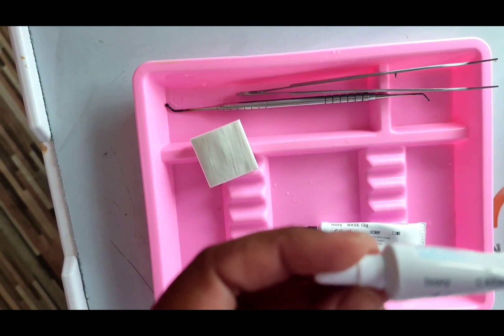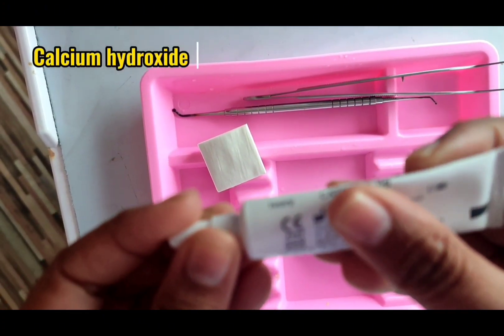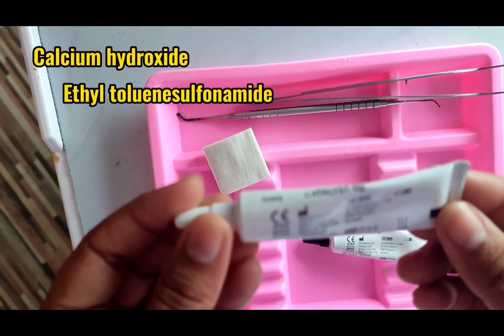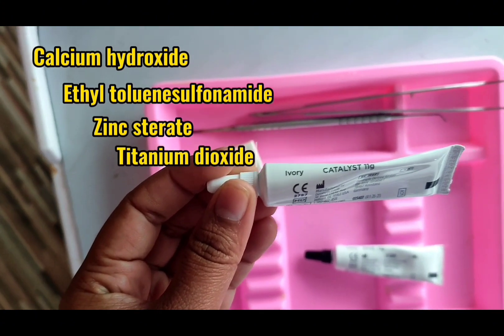The catalyst paste is composed of calcium hydroxide, ethyl toluene sulfonamide, zinc stearate, titanium dioxide, zinc oxide, and iron oxide.